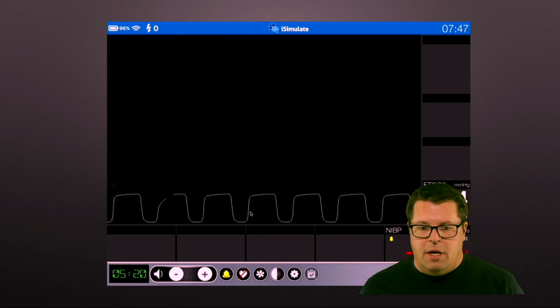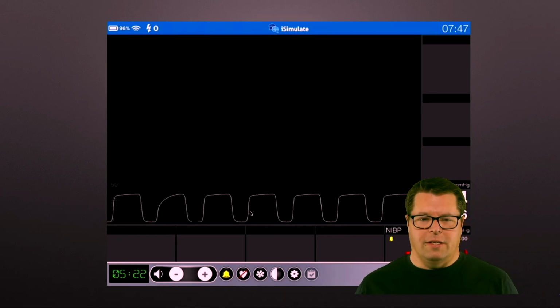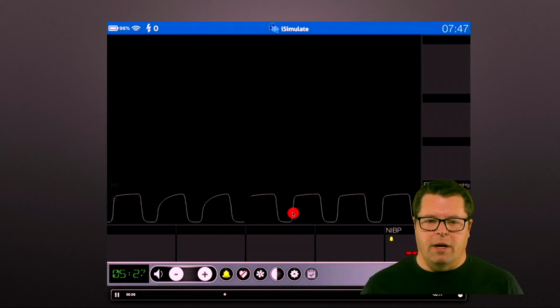Let's look at some other ones. Say that instead of, again, you have some pictures of normal here. Say you start getting something more like this, and you notice that this back corner, kind of right here, is starting to get kind of, well, smushed out. You still have this front corner.